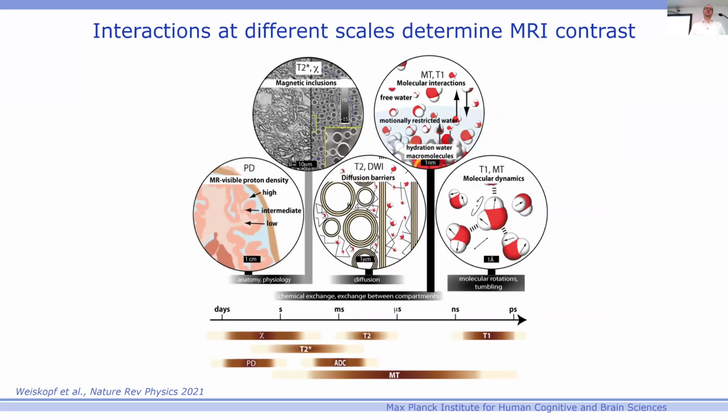Some of you might wonder, why does this work at all using MRI? We have these huge voxels, millimeter sized. Why do we get information about the microstructure that's much smaller? And there physics comes to our rescue. We are lucky in a sense that even though the MR signal comes from the spin ensembles of protons we measure, so we wouldn't expect any contrast, indeed we get contrast, and we get contrast that depends on the microstructure itself.